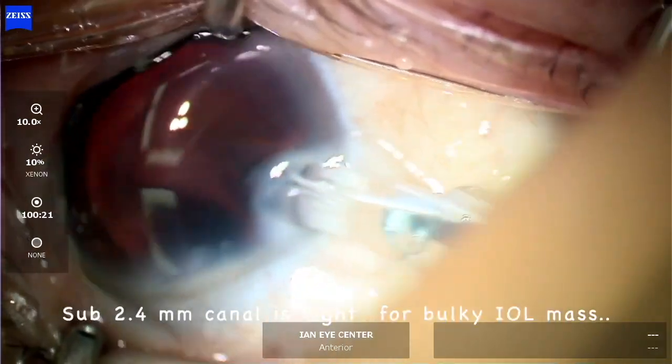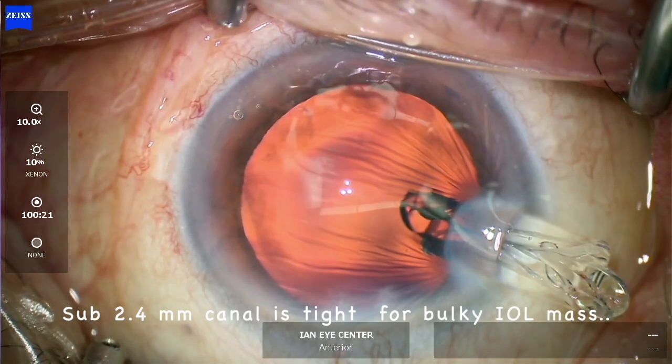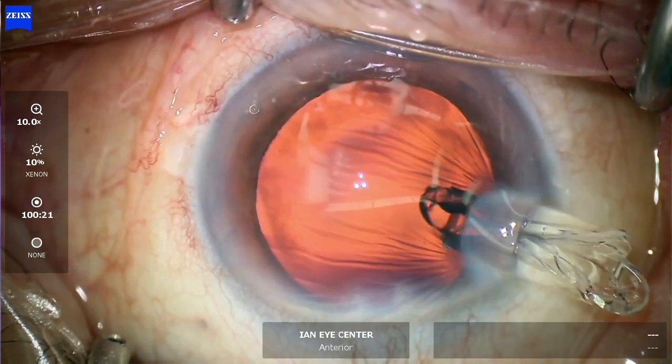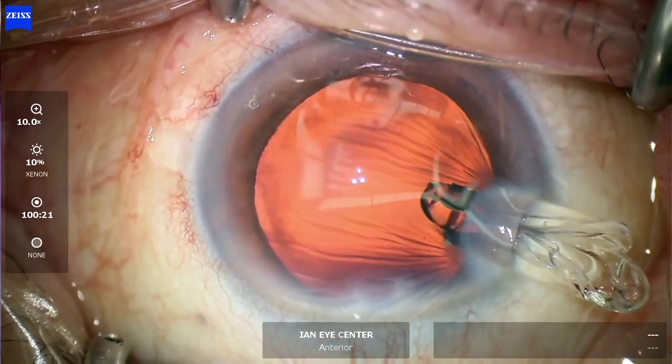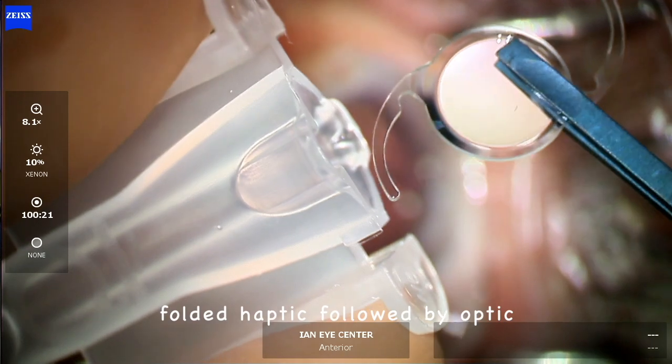One challenge encountered during the insertion process was the bulkiness of the folded haptic and optic, which occasionally caused kinking in the corneal incision wound. When the folded haptic and optic were inserted together, they could enlarge the injector cartridge canal, leading to the folded mass getting stuck in the incision tunnel.